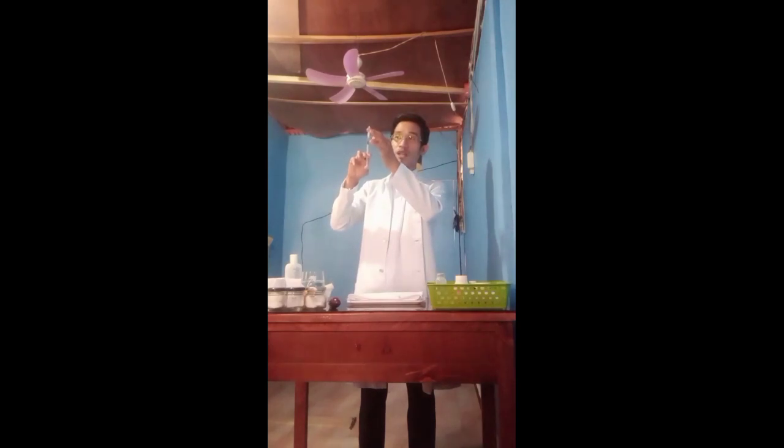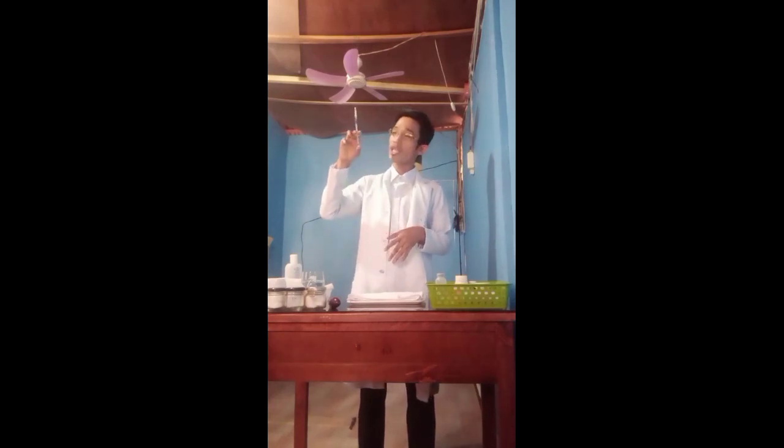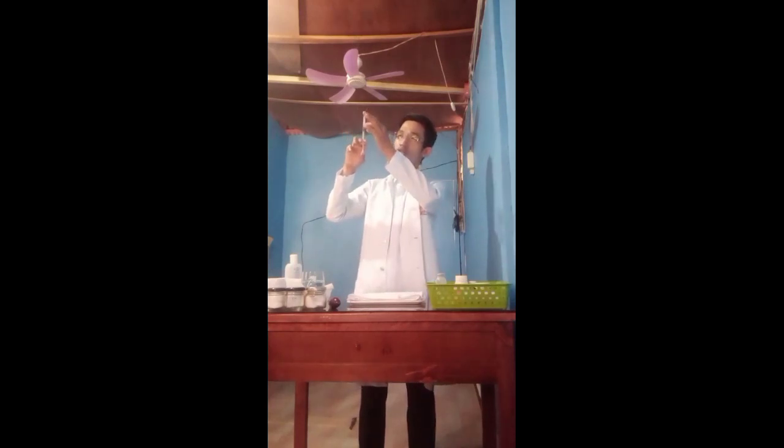So next is to remove the needle from the vial by pulling back on the barrel of the syringe. So done. This is to prevent accidentally pulling the plunger and separating it from the barrel. Hold the syringe at eye level, just like this, at a 90-degree angle to ensure correct volume and absence of air bubbles. To remove any remaining air, tap the barrel to dislodge air bubbles. Draw back slightly on the plunger, then push the plunger upward to eject the air.